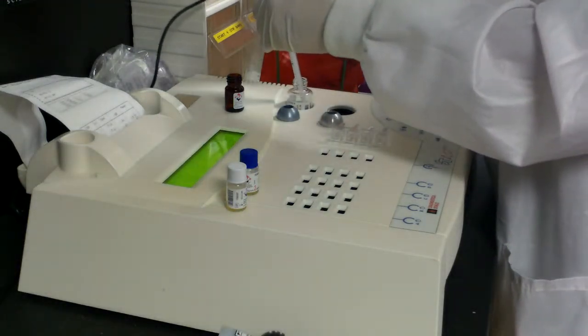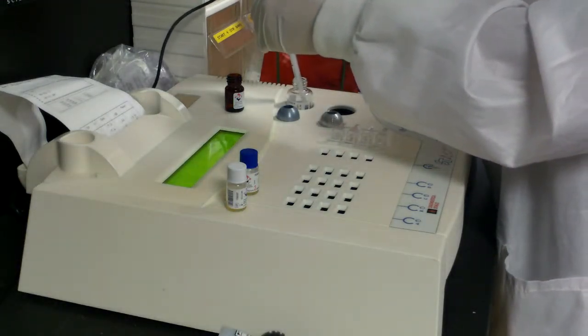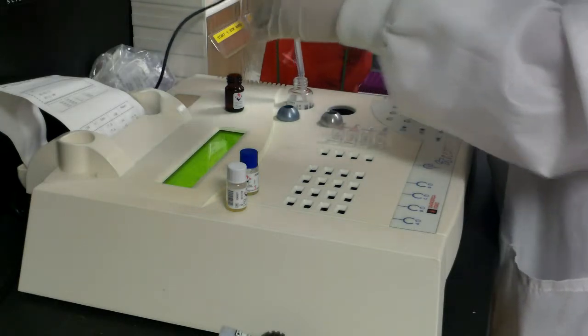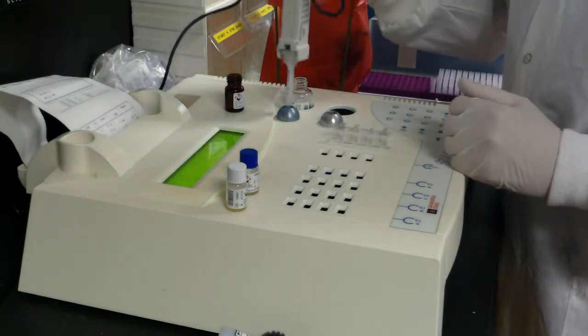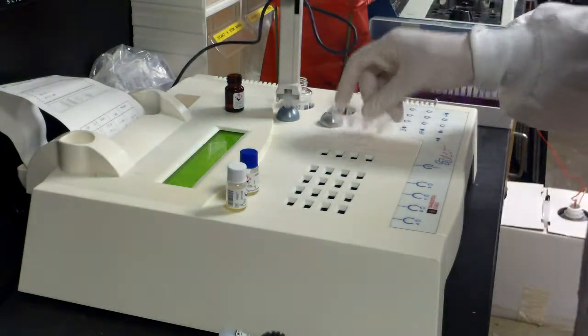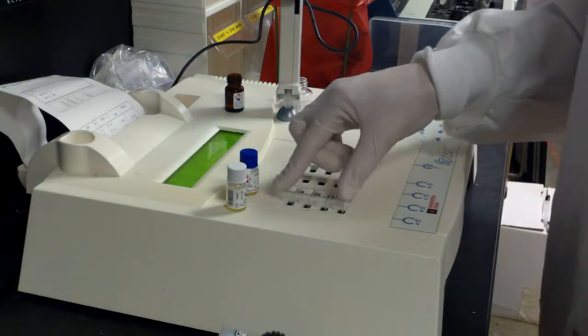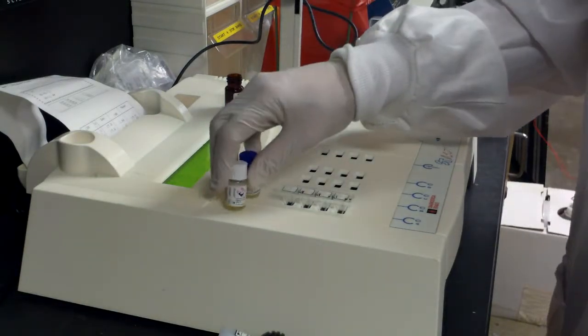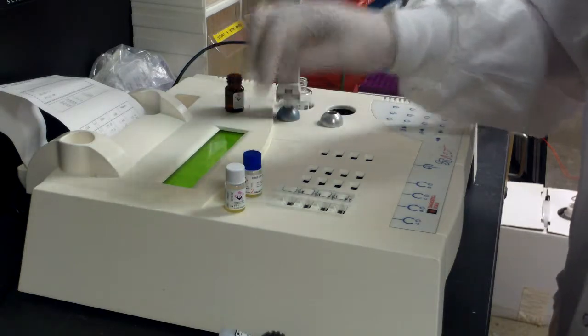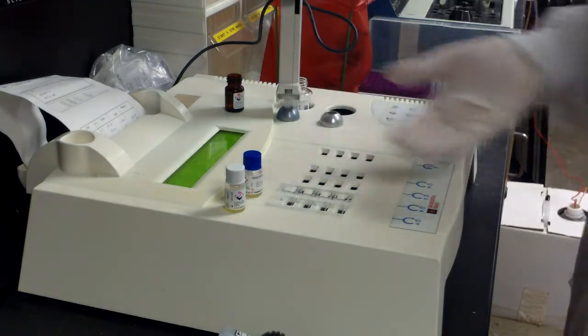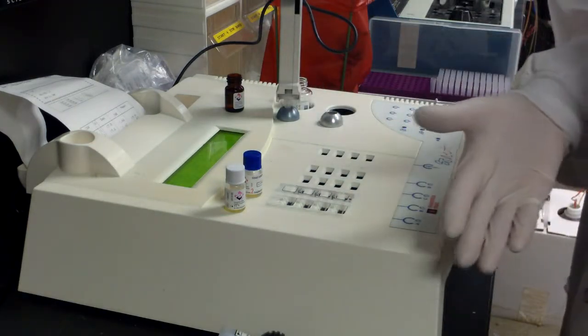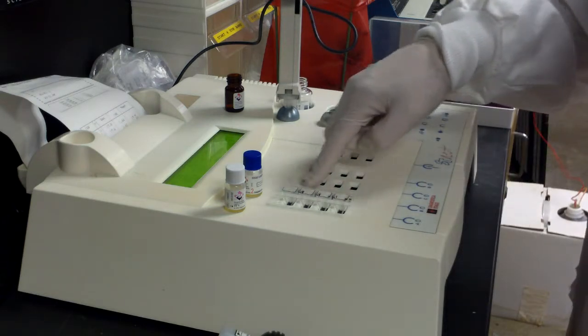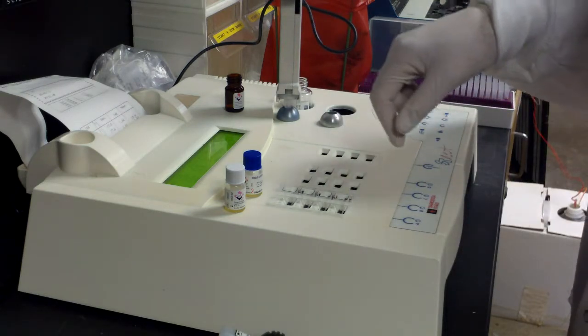You're going to put the cuvette into well A. Once again, today we're just going to do two normal and two abnormal controls. The patients would be run the exact same way - you could do a cuvette and put patient one in two of them, patient two in two of them.